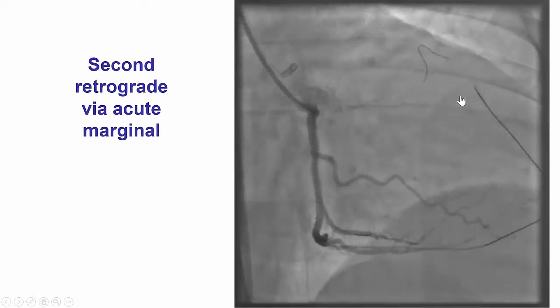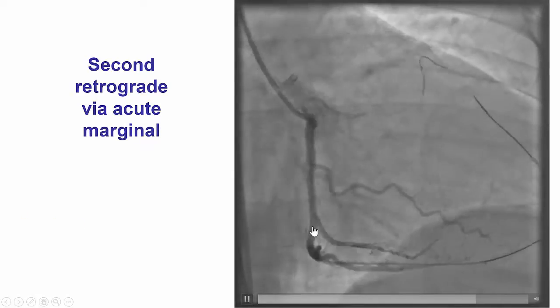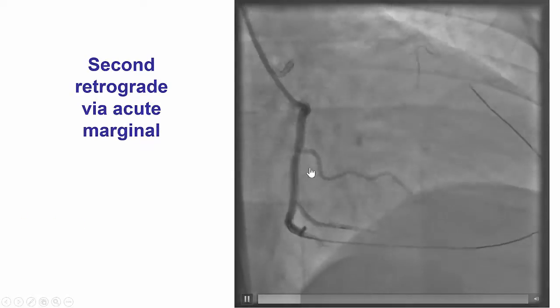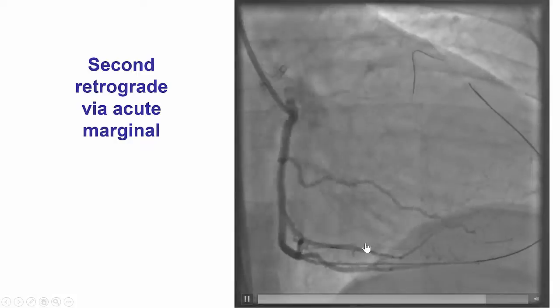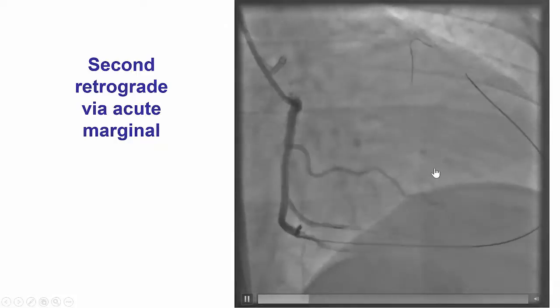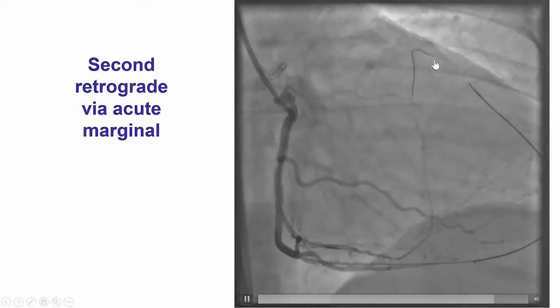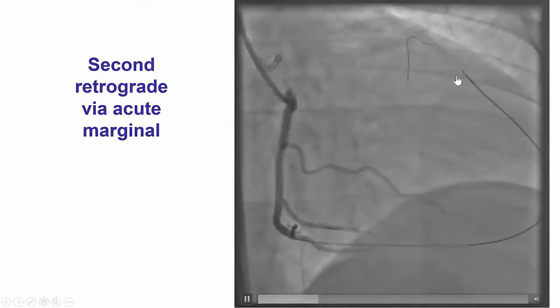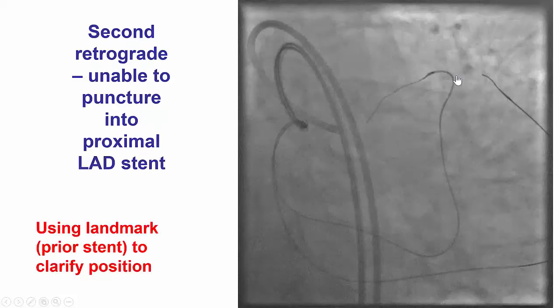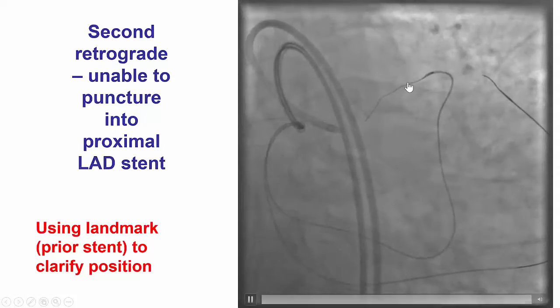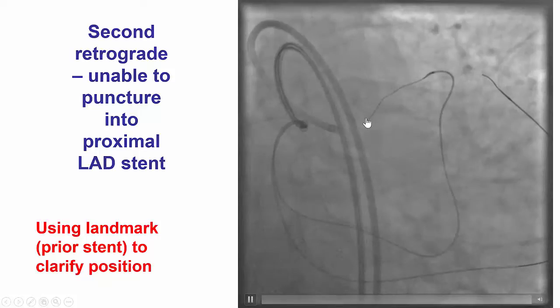We performed a second retrograde crossing through a second microcatheter from another septal collateral and were able to advance a guidewire into the mid-LAD, and then retrograde advance a wire close to the proximal LAD.